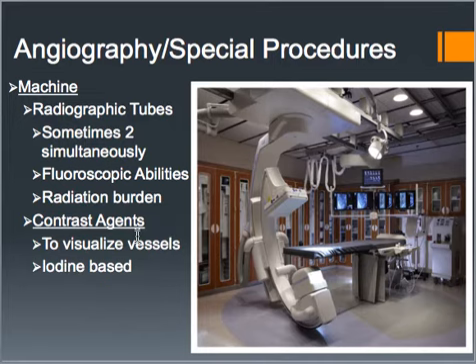The machines either use fluoroscopy, and some of them are capable of creating those CT slices. So a lot of times they'll do small little snippets of CT. Depending on the length of these exams, they can be a larger radiation burden. You know, it's live fluoroscopy, and some of these procedures can last between an hour to 2 hours, 3 hours, depending on what they're doing. So that could add up to a lot of radiation. We also use an iodine-based contrast to help visualize those vessels.